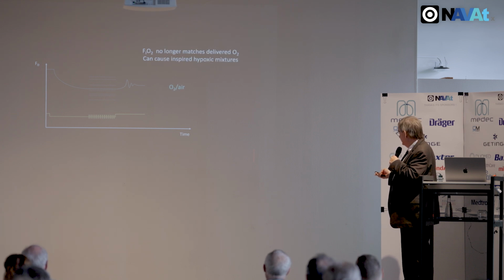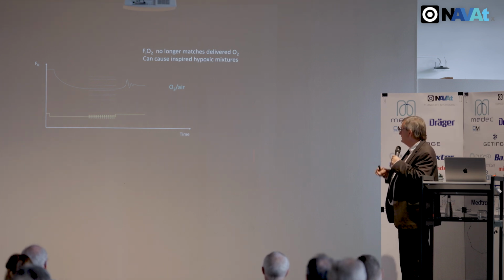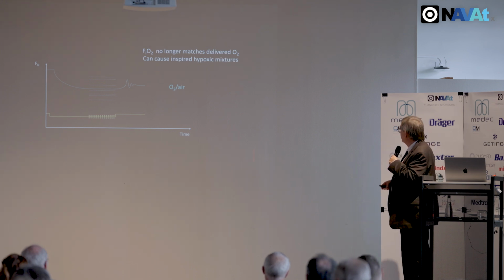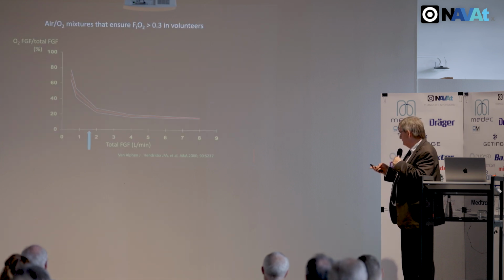And of course, the same principles that apply to inhaled anesthetic agents apply to oxygen. The inspired oxygen concentration, which you measure with a gas analyzer, will no longer match what you dial on the flow meters. Again, because of this dilution effect, you can get inspired hypoxic mixtures.